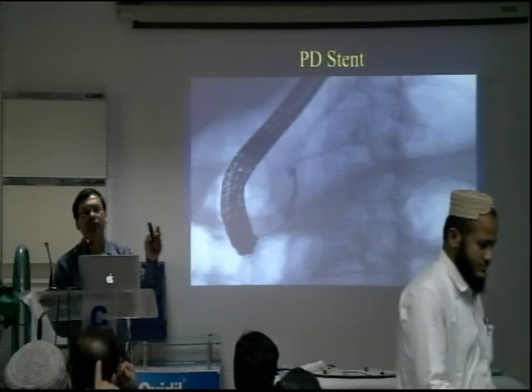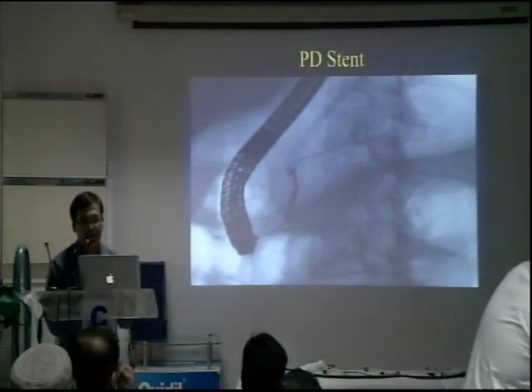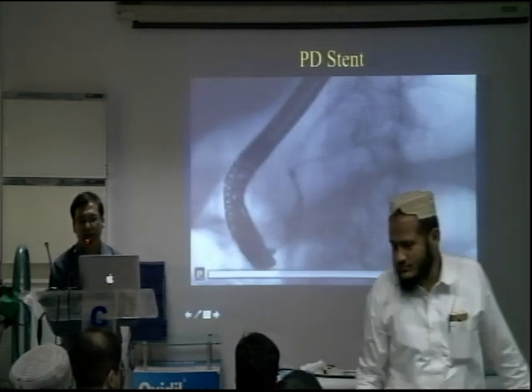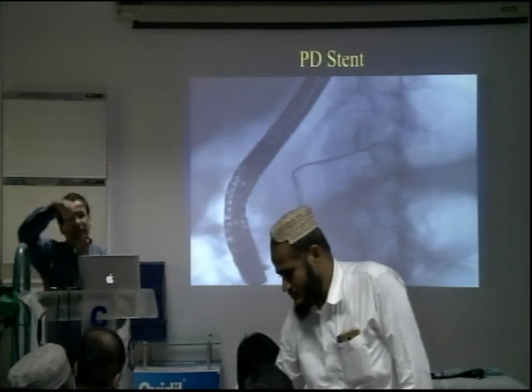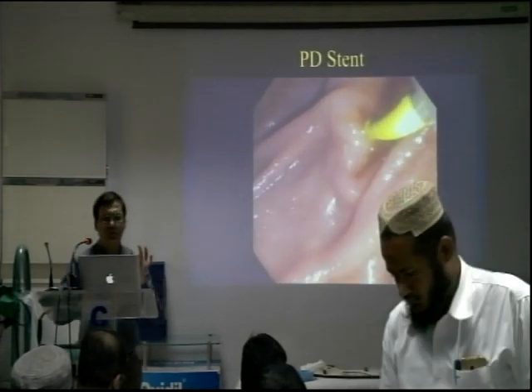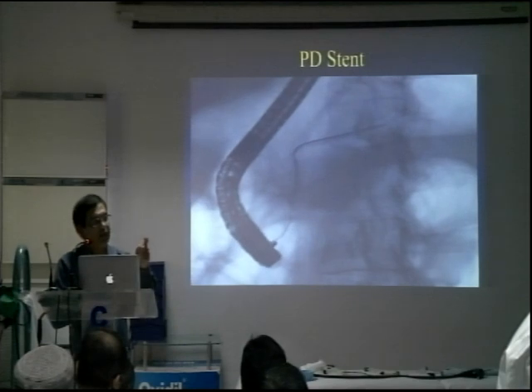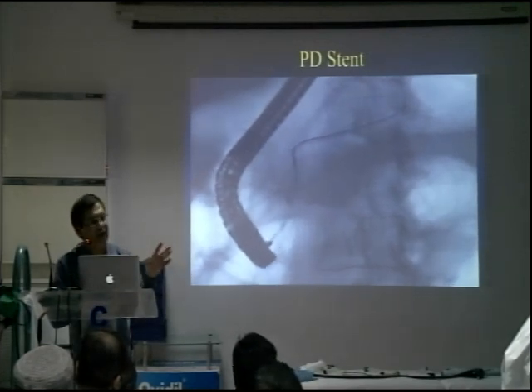It went very smoothly. Yeah, it went to the dorsal duct. Okay. So, which is fine. You just need to change the direction, then bring it back. And whenever you can, if you can make a loop on the wire, that is really always good for the pancreatic orifice, pancreatic duct, I should say. Because the loop always follows the main duct. It never goes into the side branch.